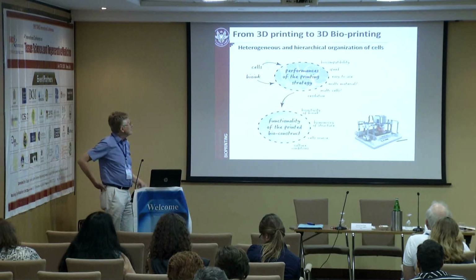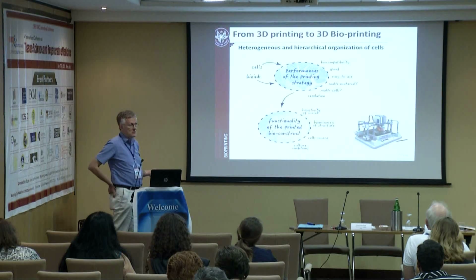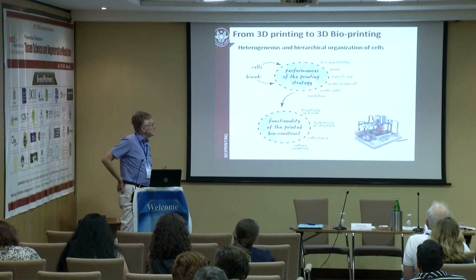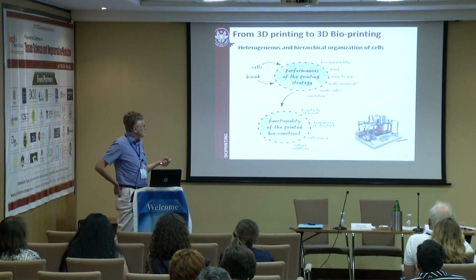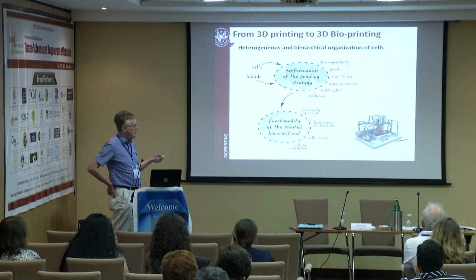So we have seen that these dispensing systems allow the deposition of a 3D structure with high fidelity and reproducibility. It's also quite easy to use and fast. We may wonder if it's possible also to print multi-material components, with cells and scaffolding material simultaneously. If we assume that this is possible, a question arises regarding the bioactivity of the bioink.